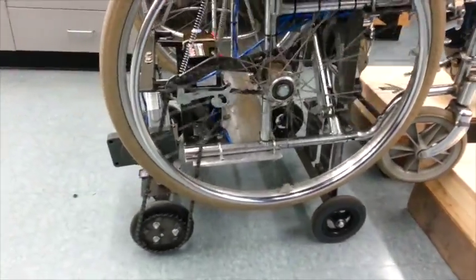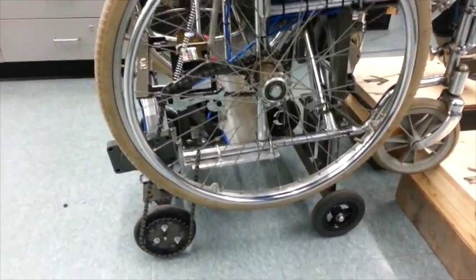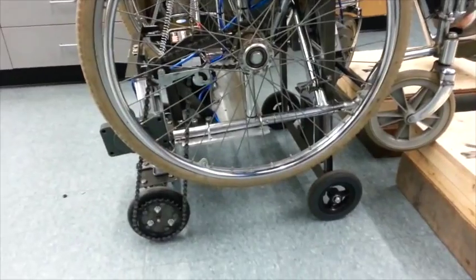The wheel is connected by a chain to the rear axle, so the chair can be moved forward when it is in the ascended position.